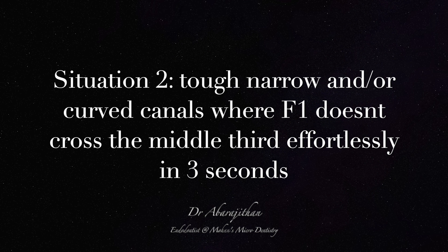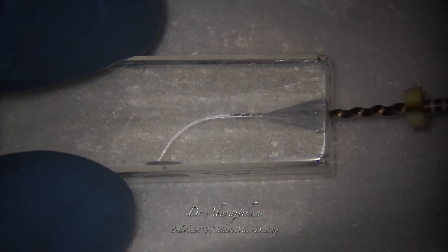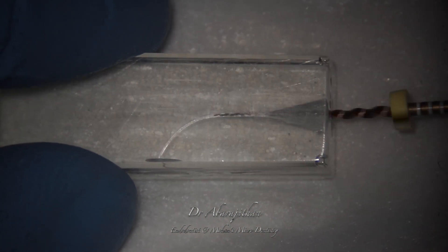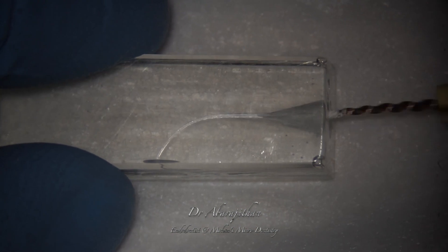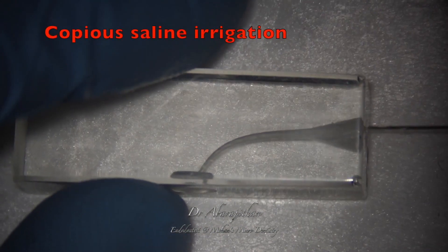Now let's take a look at situation number 2, which is difficult, tough, curved or narrow canals. In such situations, we also follow the same technique. We start with an F1 file, but here you can see that the F1 file is finding it difficult to go beyond the middle third.